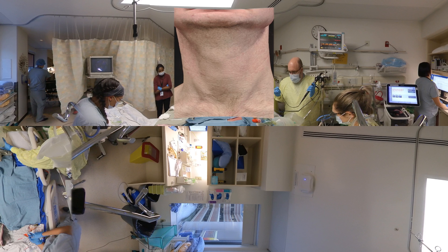This image shows the superficial anatomy of the anterior neck in preparation for either a cricothyroidotomy or a tracheostomy. The thyroid cartilage is easily palpable and is the most prominent structure in the anterior midline of the neck. Just below this is the soft spot, or the cricothyroid membrane, which is where we would typically perform a cricothyroidotomy. The thickened cartilage below the cricothyroid membrane is the cricoid cartilage.